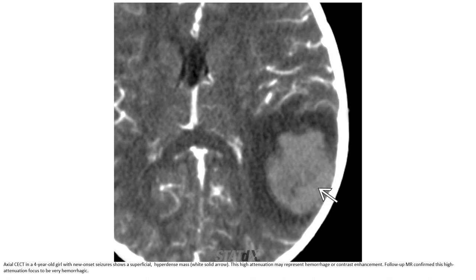Enhanced CT in a four-year-old with new onset seizure shows a supratentorial hyperdense lesion. This hyperdensity may represent hemorrhage, with enhancement. This high-attenuation focus is likely hemorrhagic in nature.